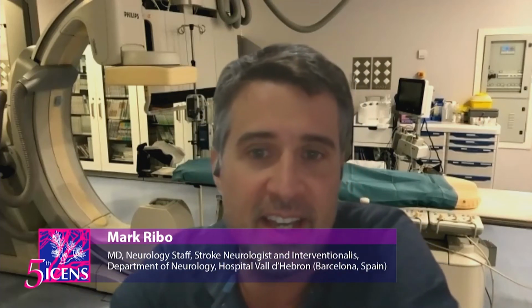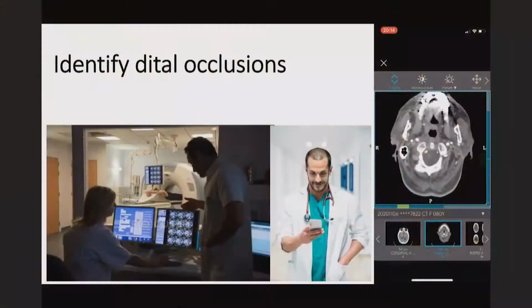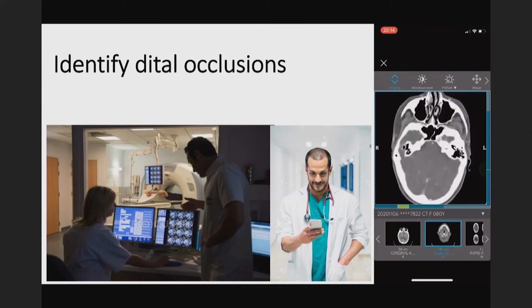Speak about distal occlusions, trial and devices. And first we need to know is how good are we identifying the distal occlusion. There's a mistake here. Most of the times the diagnosis is made in these circumstances, but more and more we take this acute, hyperacute diagnosis using our mobile phones, our cell phones, and we are assessing CTA on our mobile devices. And therefore, the decisions to treat with endovascular treatment are made within minutes.